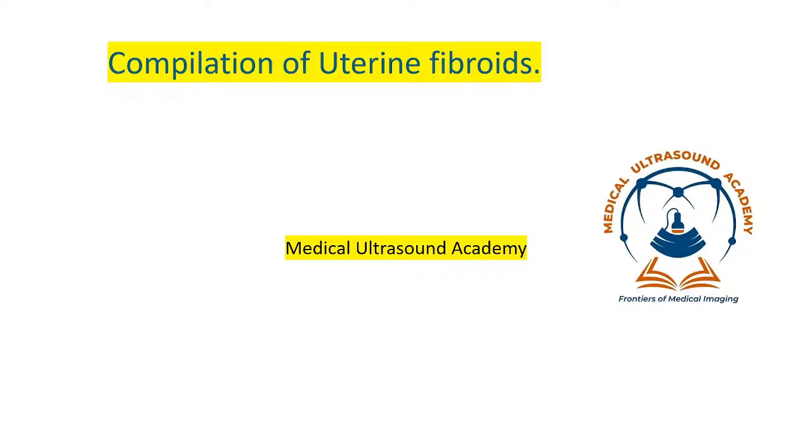We are going to have a compilation of all the pelvic pathologies. We are going to do it stage-wise because there are too many. We can't do them all in a single presentation. So we are going to subcategorize these different pathologies.